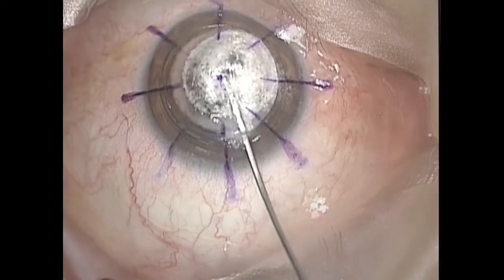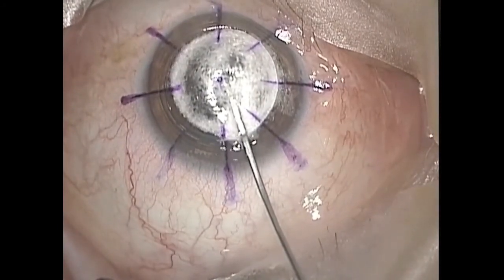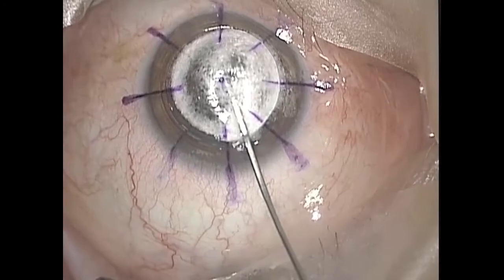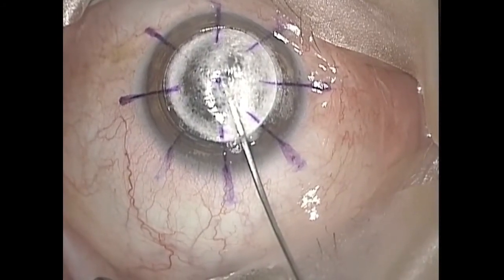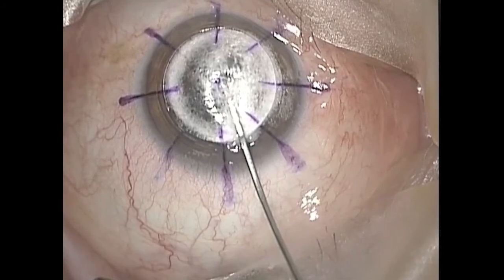With the big bubble technique, pneumatic dissection rarely extends far into the corneal periphery, and attempts at enlarging the size of the bubble may make it burst.